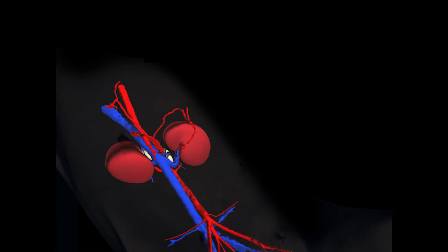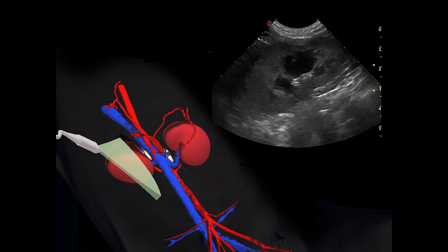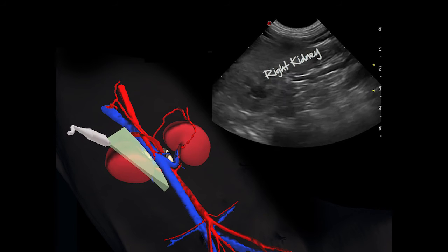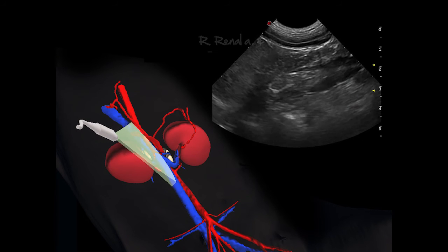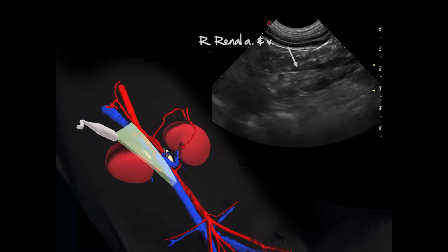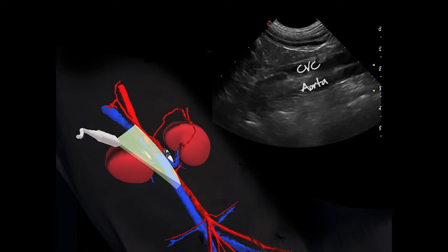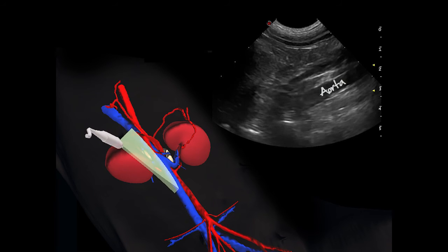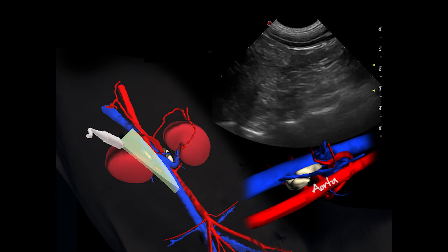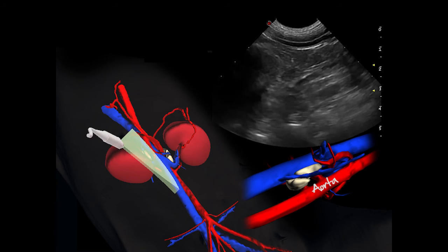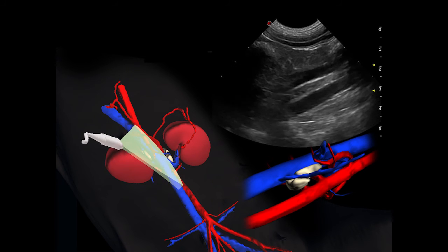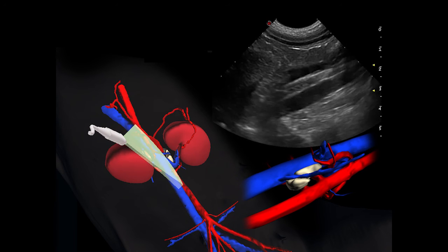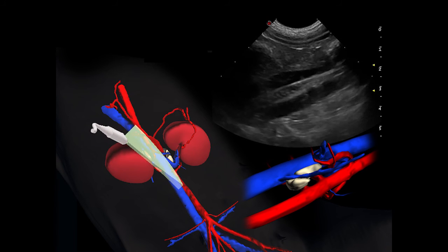In B mode, follow the same steps. First identify the right kidney, and then slide the probe medially while following the right renal artery and vein all the way to the caudal vena cava, just ventral to the aorta. The aorta is differentiated from the vena cava by its obvious pulsation. The feces in the ascending and transverse colon are often a source of acoustic shadowing and reverberation, which will sometimes limit your exam.